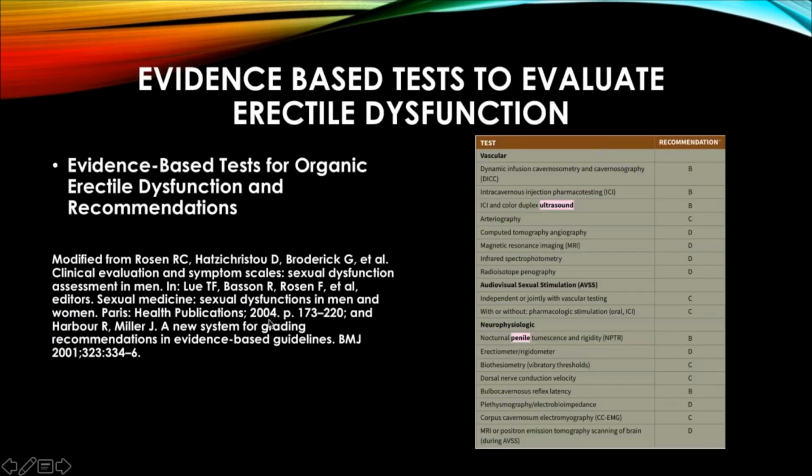And this is actually from the book Sexual Dysfunction Assessment in Men. These are the recommendations for studies to work up men with erectile dysfunction.